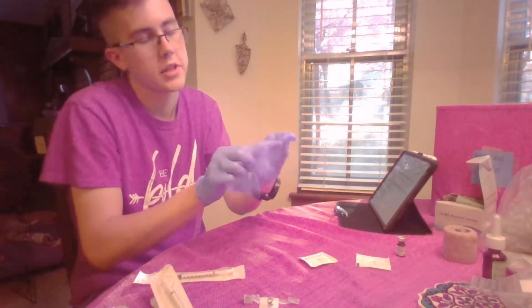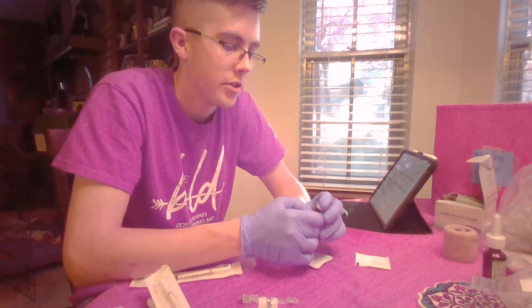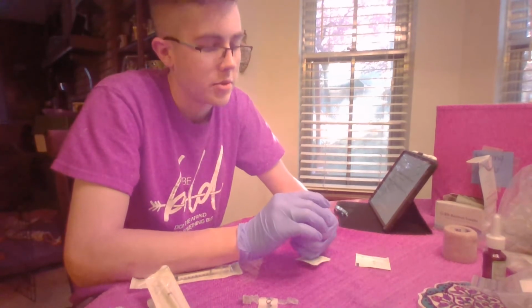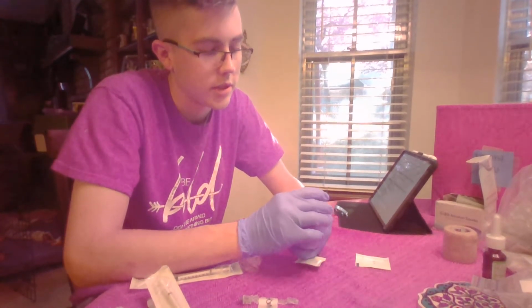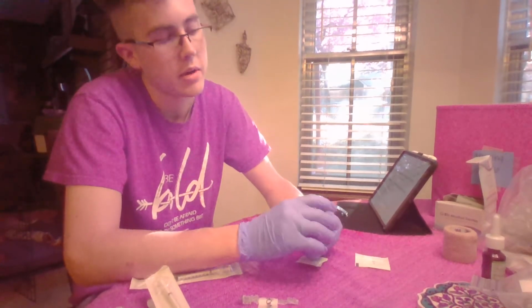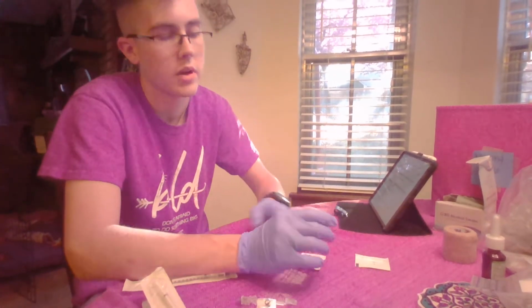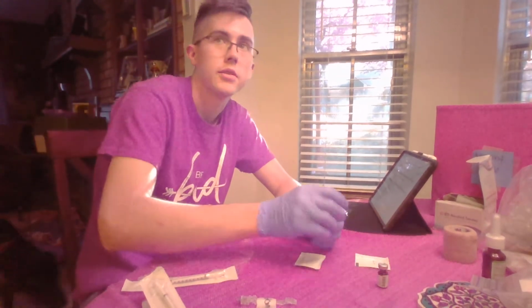So starting off, first thing that I need to do is inspect my medication. So looking at it, make sure that the title of the medication is the title of the medication that I'm needing. Check to make sure that it's the right dosage, if I can give it the right route. So this one, see if I can give it intranasally. I will also inspect the medication for clarity, check the expiration date. And then I'm also going to want to make sure that I'm giving this at the right time, and this is the proper time that I should be giving this medication.